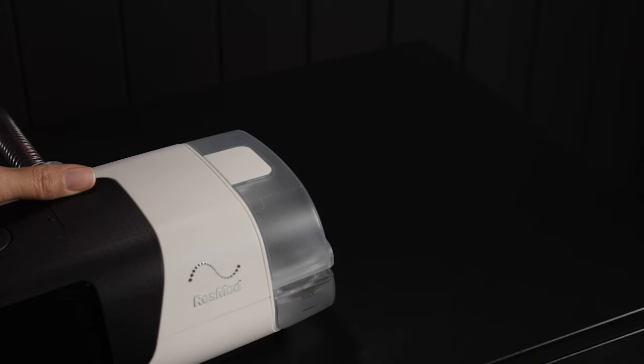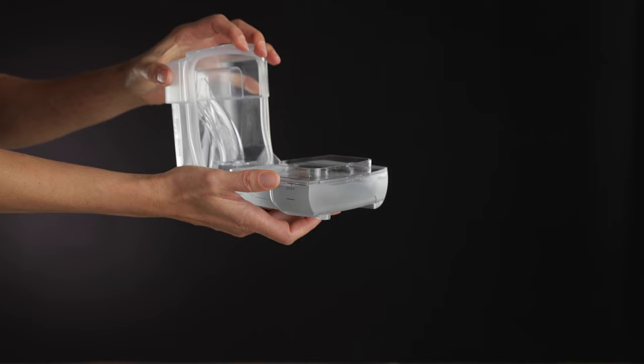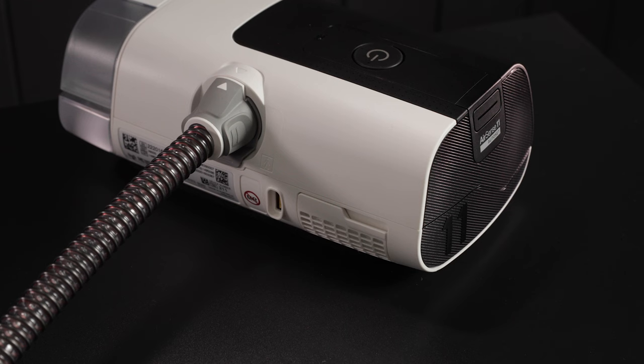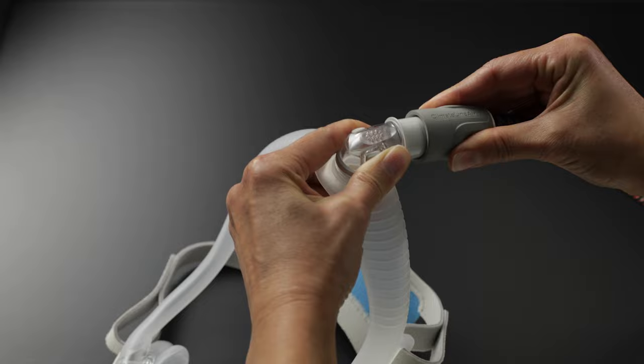Hold the humidifier tub at the top and bottom, press it gently, and pull it away from the device. Open the humidifier tub and discard any remaining water. Pinch the cuff of the air tubing and gently pull it away from the device. Hold both the cuff of the air tubing and the swivel of the mask, then gently pull apart.